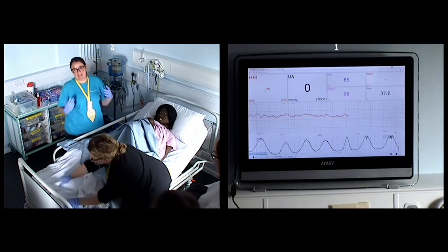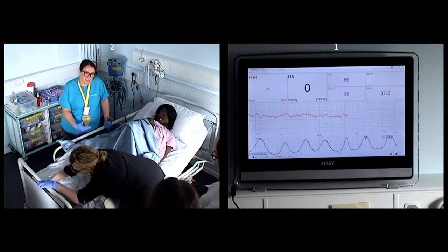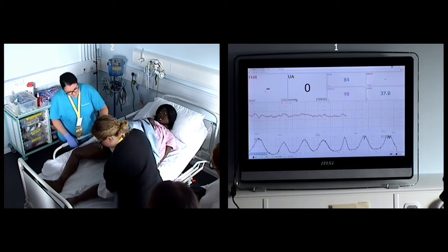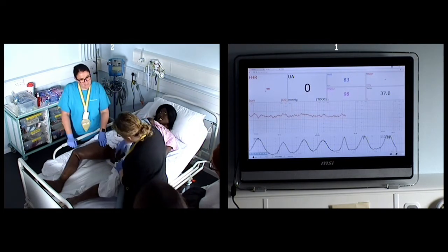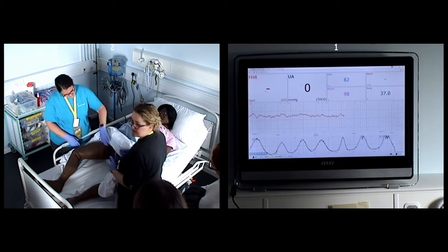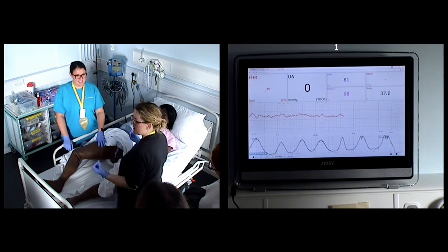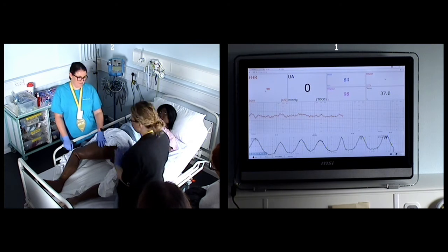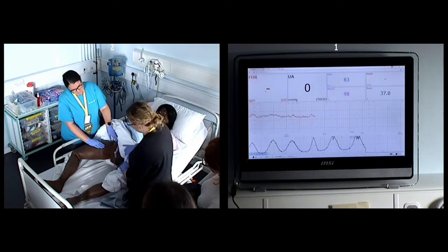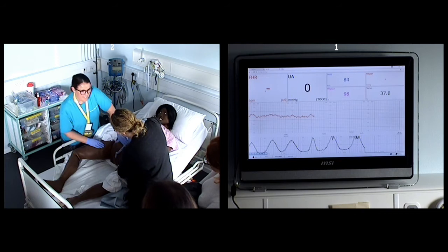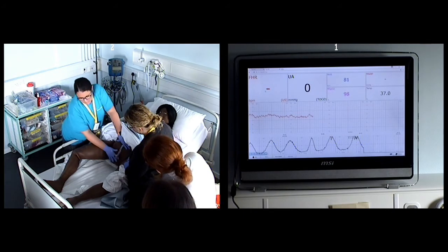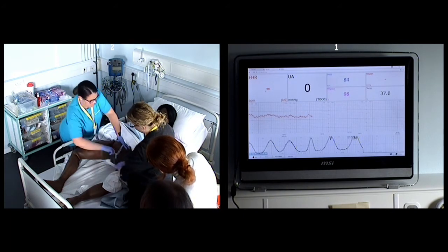Now we consider how she's going to deliver the placenta — is she going to have an active third stage and have some drugs, or deliver it herself? We're going to assume we've given her some drugs. We're going to leave the cord attached to the baby and leave it pulsating — we wait until the cord is completely white so the baby gets all the blood intended for it. We know the benefits of delayed cord clamping, so unless there was an emergency, we would leave the cord.